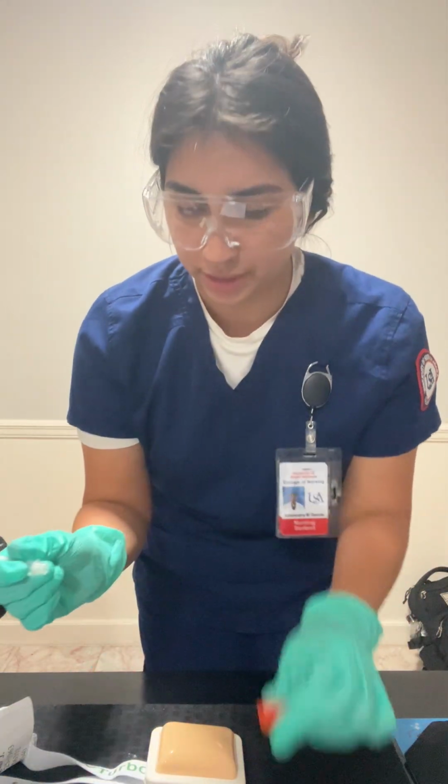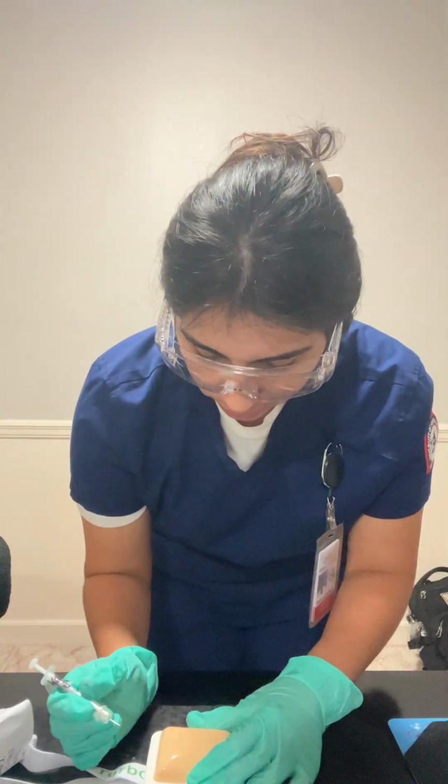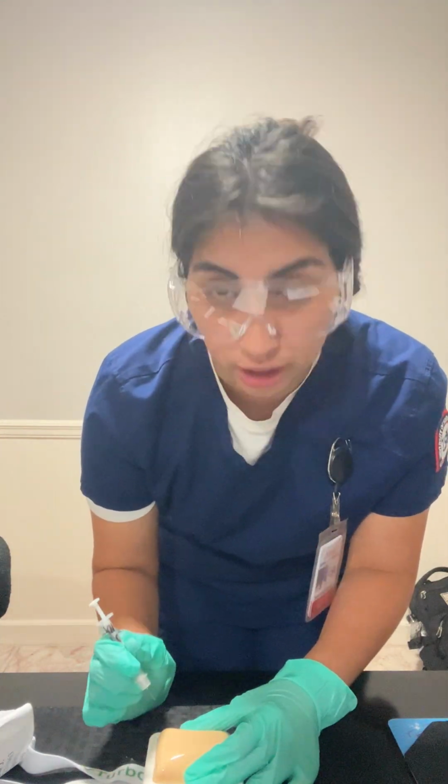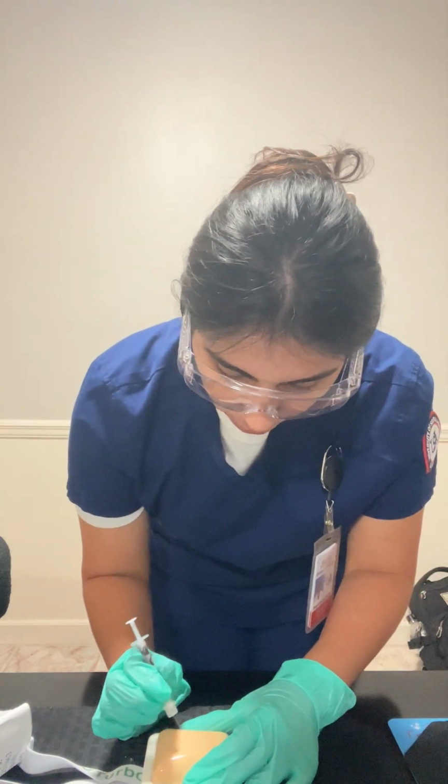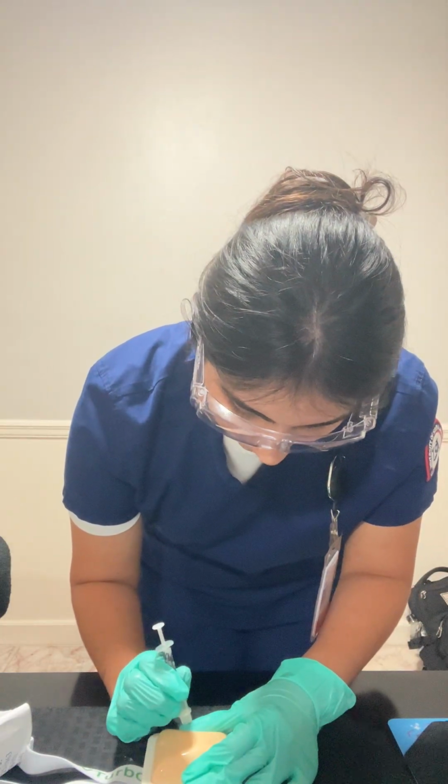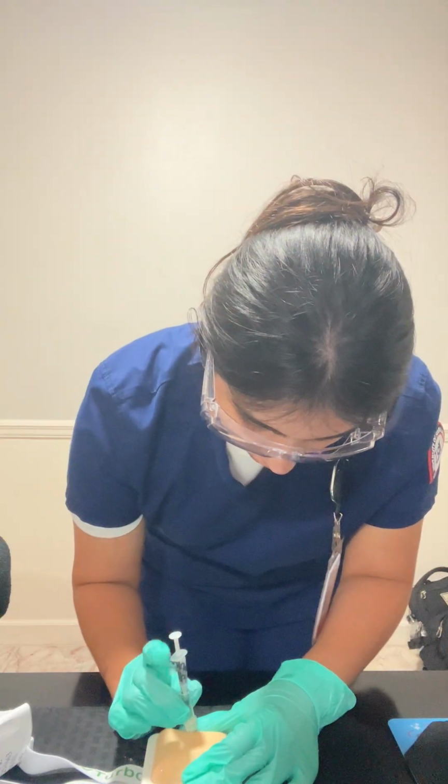Actually, I'm going to open this and pinch the skin and do a subcutaneous injection at a 45-degree angle.